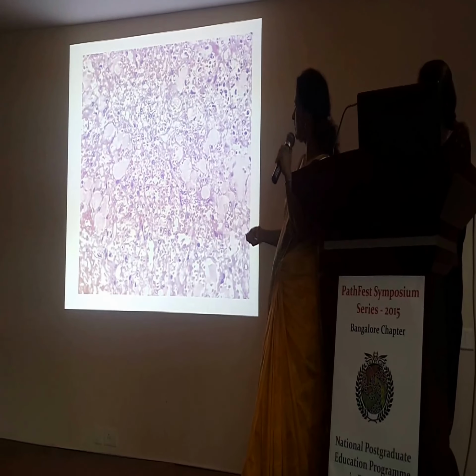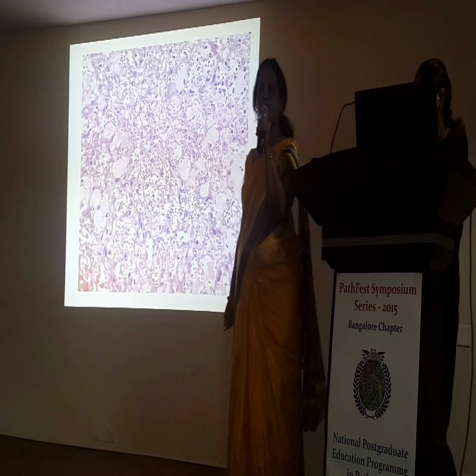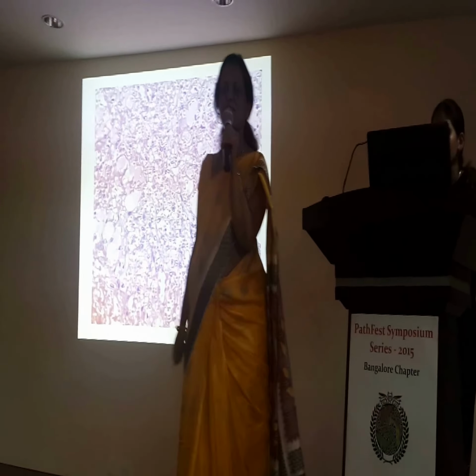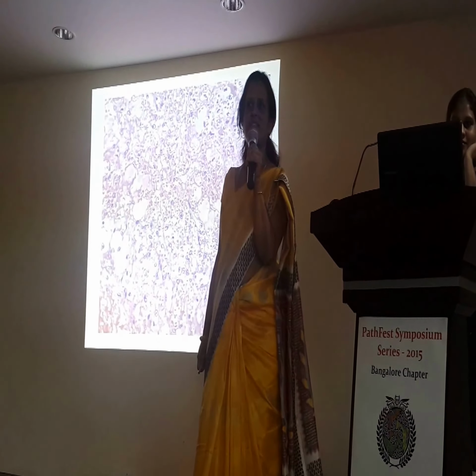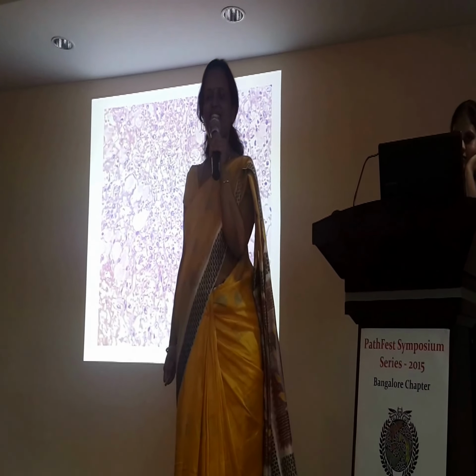What are all these? Blood vessels? It's a broad term, right? We need to give the name to a blood vessel. Elastic arteries? Veins? Capillaries. Anything finer than that?